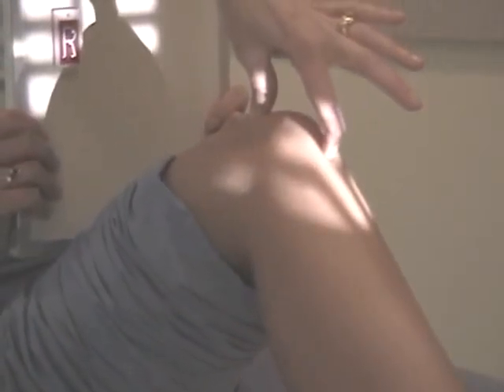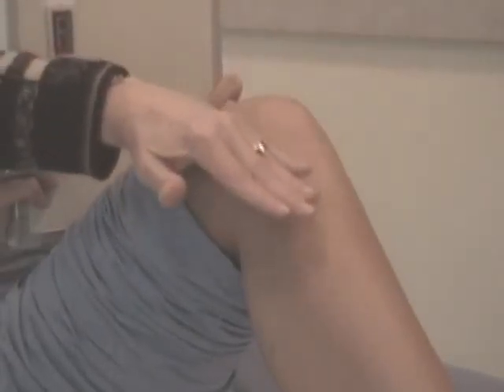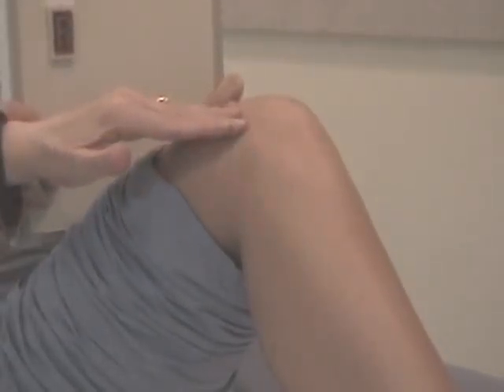Now if she bends her knee more, see how my fingers are almost parallel and the tube is angling more, you have to change that. Or if the knee flexion changes, your tube angle changes. So you have to get a vision of the joint space and angle your tube to come in right through that joint space.